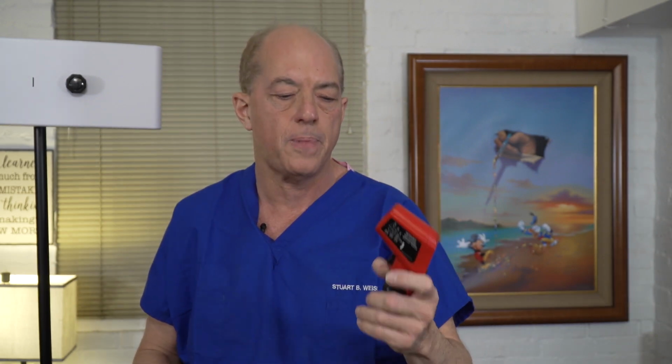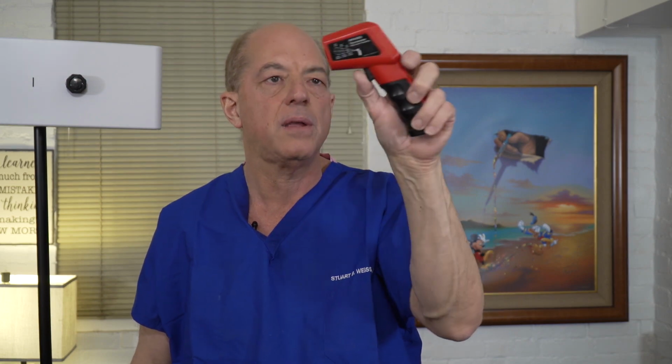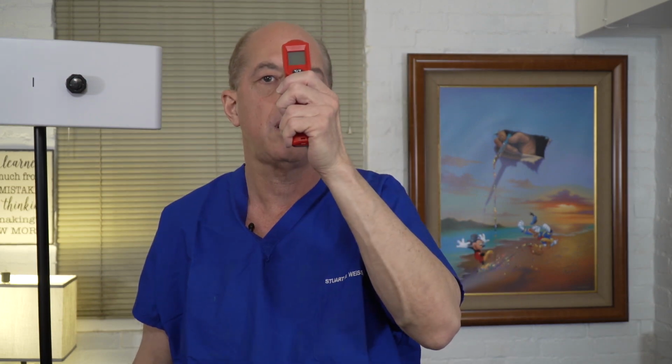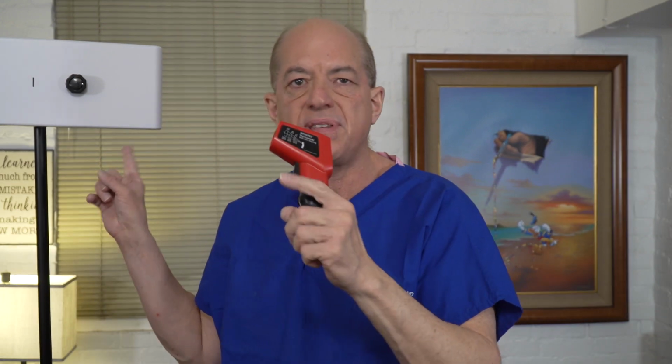So how does this work? Basically, you get within 3 or 4 inches of somebody's forehead, you squeeze the trigger, and then you read the temperature. Now some of these don't have such great accuracy, and you need to be careful with both systems.